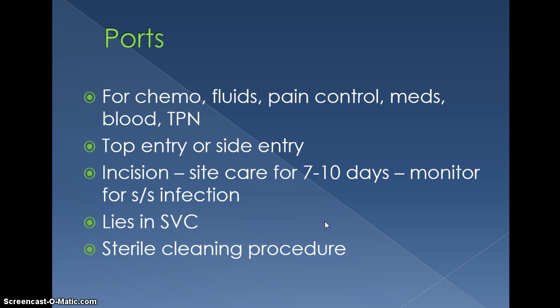The patient with a port may need to get prophylactic antibiotics before any dental or surgical procedures to prevent contamination, and he has to make sure that he tells his dentist or practitioner about the device. That's the importance of him carrying that card, so that he has all the information for that person.